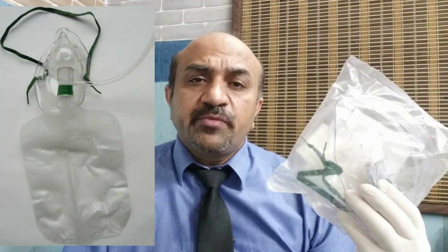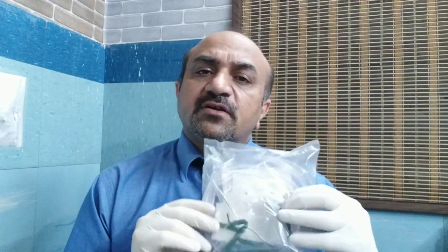the non-rebreather face mask. In the non-rebreather face mask, there is a bag which works as a reservoir, and the patient can breathe oxygen from a high oxygen containing reservoir. This non-rebreather face mask can give up to 15 liters per minute of oxygen, and as I already mentioned in a previous video, 1 liter per minute of additional oxygen adds 4% of FiO2, and on room air it is only 21%.